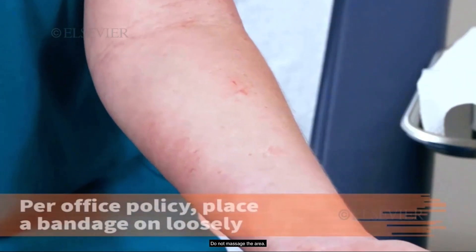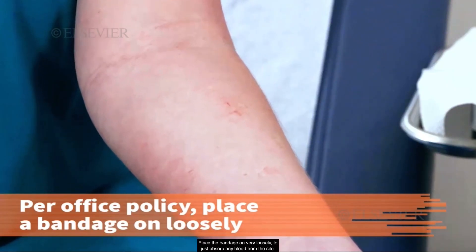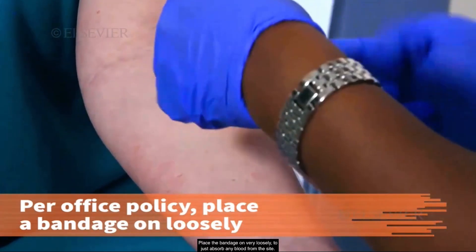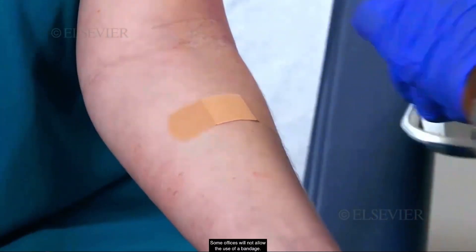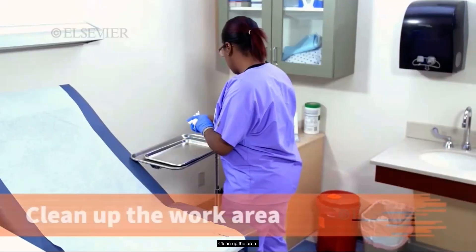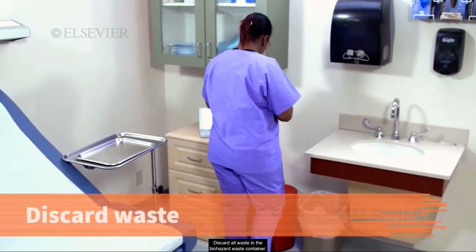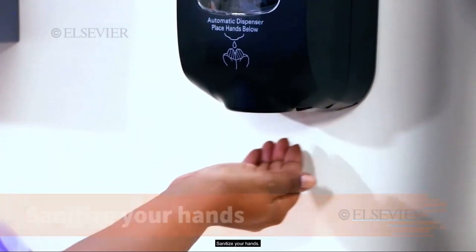Do not massage the area. Offer a bandage, placing it on very loosely to just absorb any blood from the site. Some offices will not allow the use of a bandage. Observe the patient for any adverse reactions. Clean up the area and discard all waste in the biohazard waste container. Sanitize your hands.